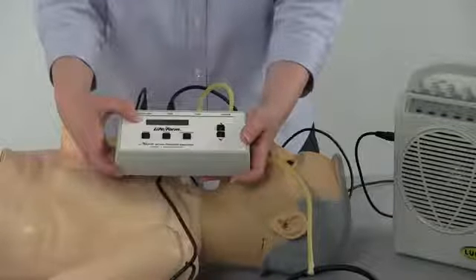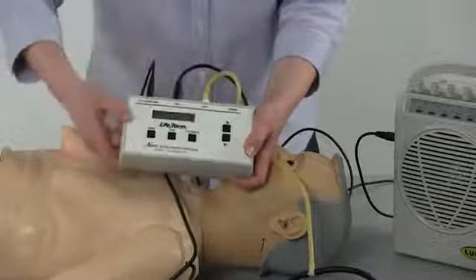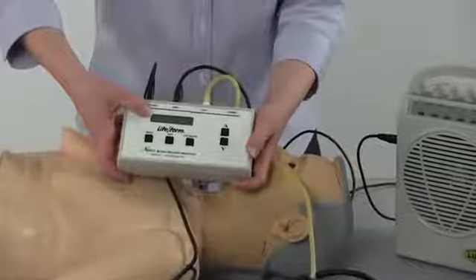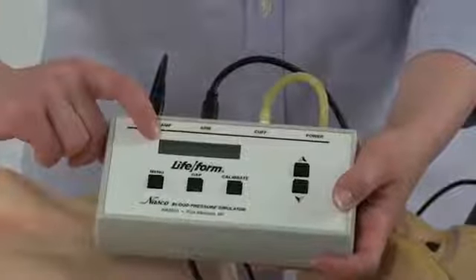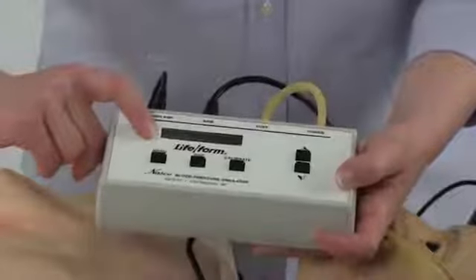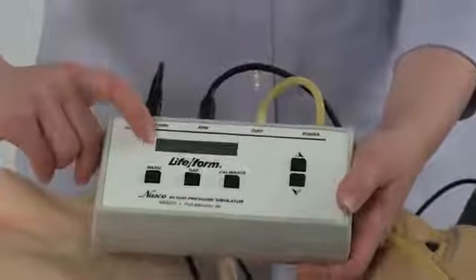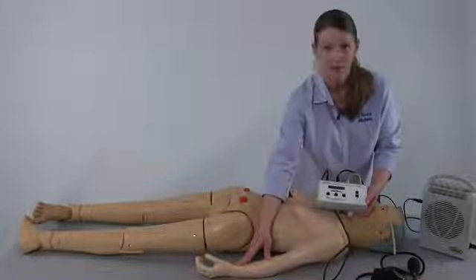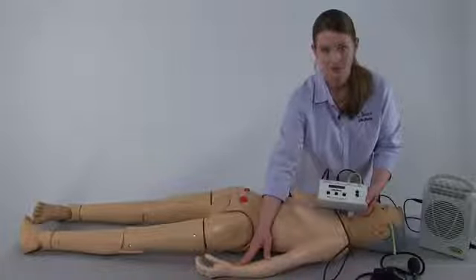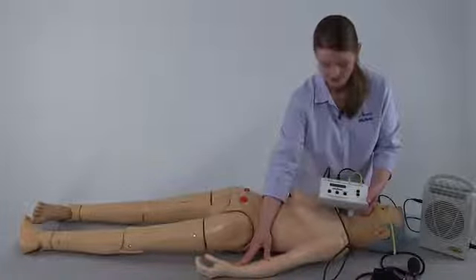Pressing the power button will turn the electronic control unit on. A home screen will come up and the display will show the last blood pressure that was completed. When the unit is brand new, the last blood pressure entered should be 120 over 80 with a heart rate of 80. When the unit is turned on and at the home screen, the palpatory pulse in the radial section of the arm will initiate. Lightly pressing in the radial section of the arm, you will feel the heart rate set at 80.